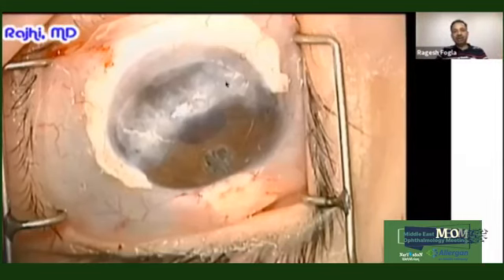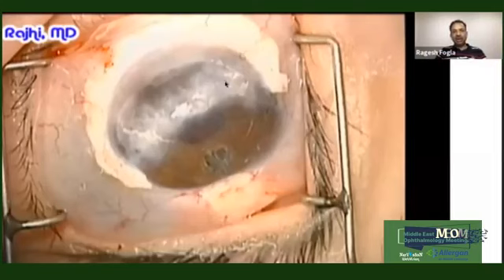And then later on, if you have to come back and do a surgery, you don't have to worry about the wound becoming very thin, not being able to suture the wound. And even if the cornea is not clear, you can do a central small penetrating keratoplasty because now you have a normal central corneal thickness. And these corneas are very prone to injury. Even if they sustain a minor trauma, they can have rupture, which can be very difficult to repair.